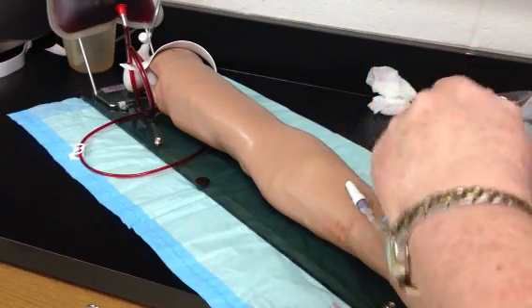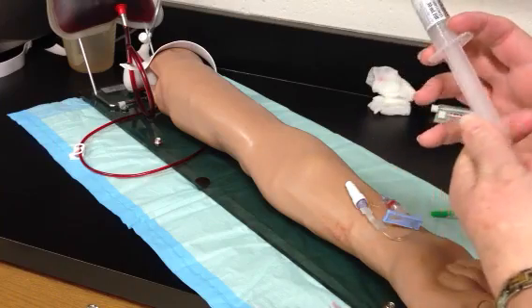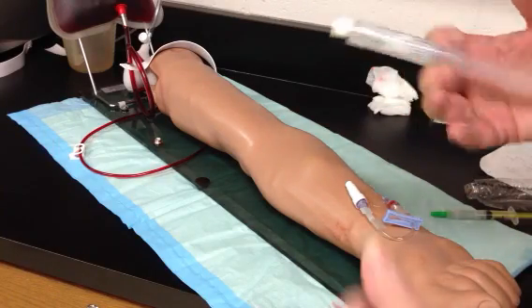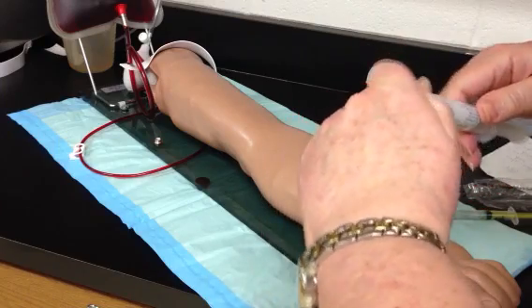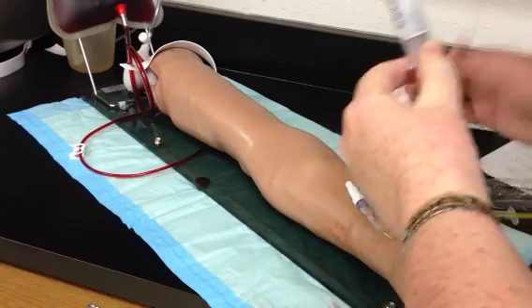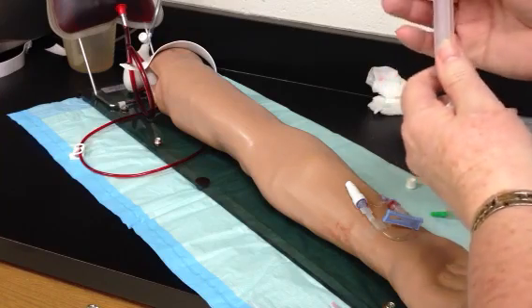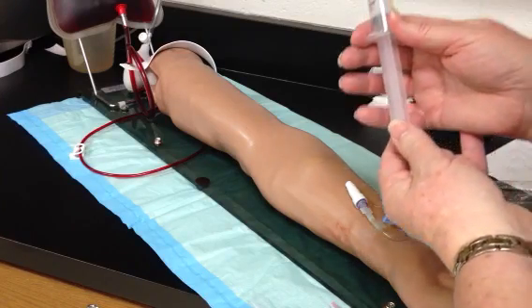get my saline open. A lot of times these are kind of stiff when you first open them, so I'll give them a little push before I open the tip of it. And then another precaution that you might take would be to pull down before you push up to purge the air.